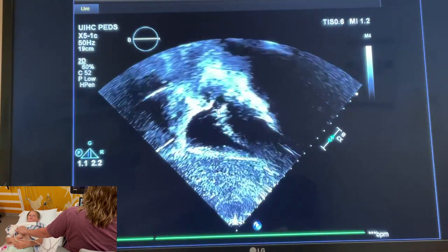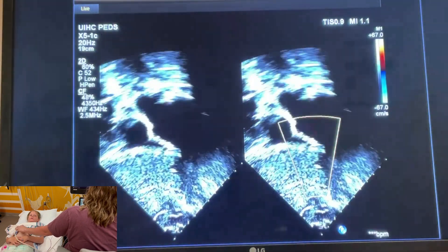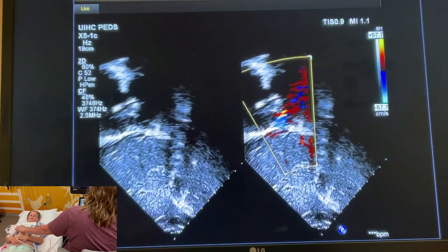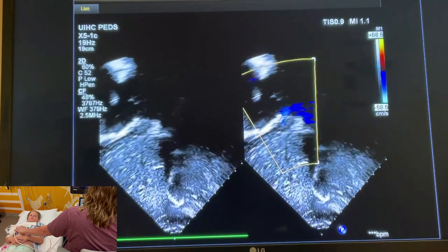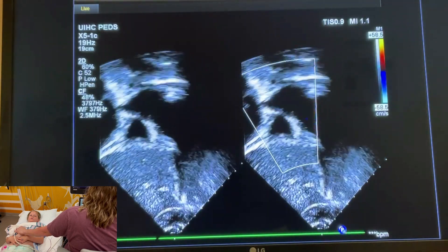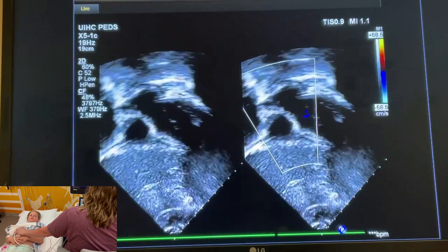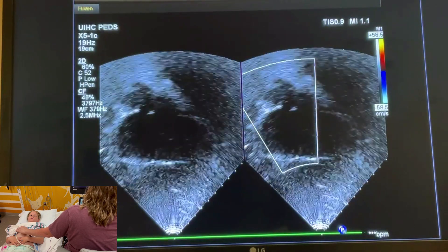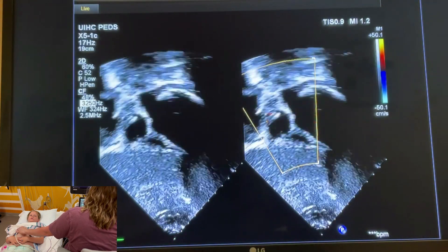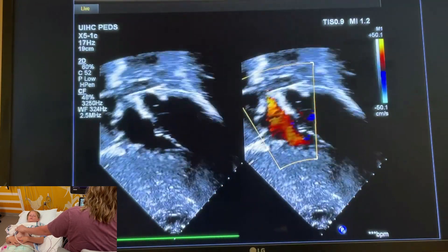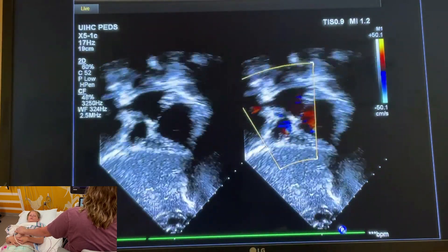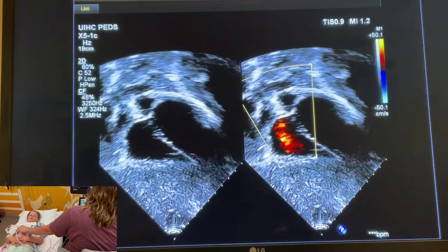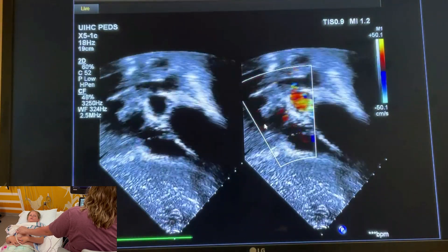Now we have to do this with color. We're going to put a color box over the interatrial septum — we're looking for ASDs — so you can see the draining SVC and IVC into the right atrium. We're going to tip up slowly to get the interatrial septum, then keep tipping, and there's aorta and pulmonary artery. Sometimes in older kids you have to reduce your Doppler scale to try and get more color to fill in. You have to be careful because you can have the SVC draining in and you might think there's some sort of ASD — that's normal anatomy, that's SVC.